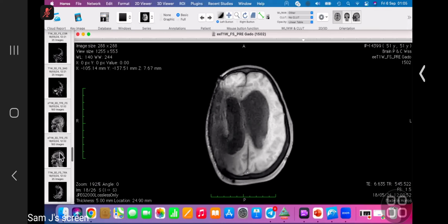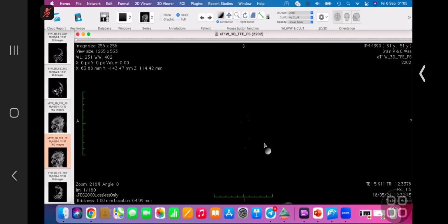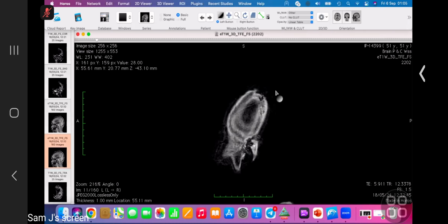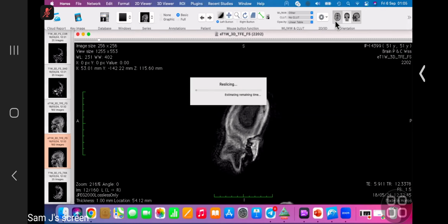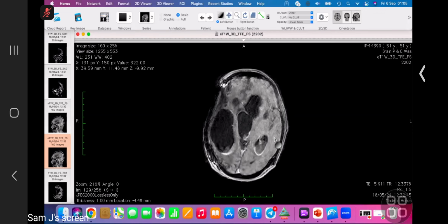We just opened it. Just a second. Yeah. Can you appreciate the enhancement very nicely?